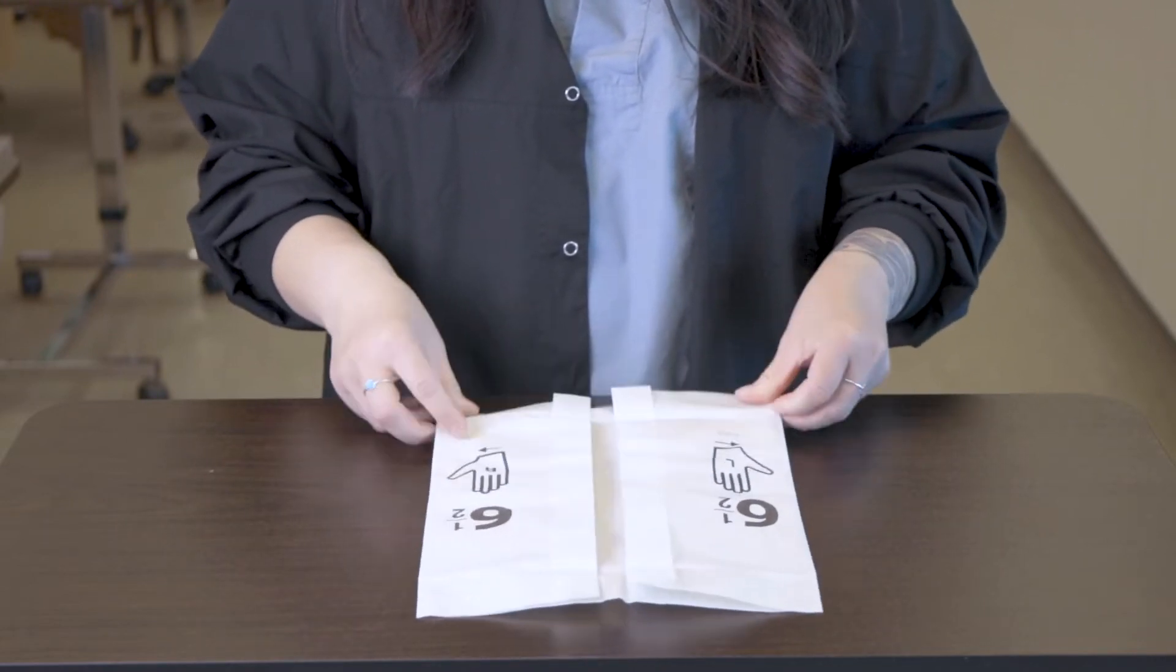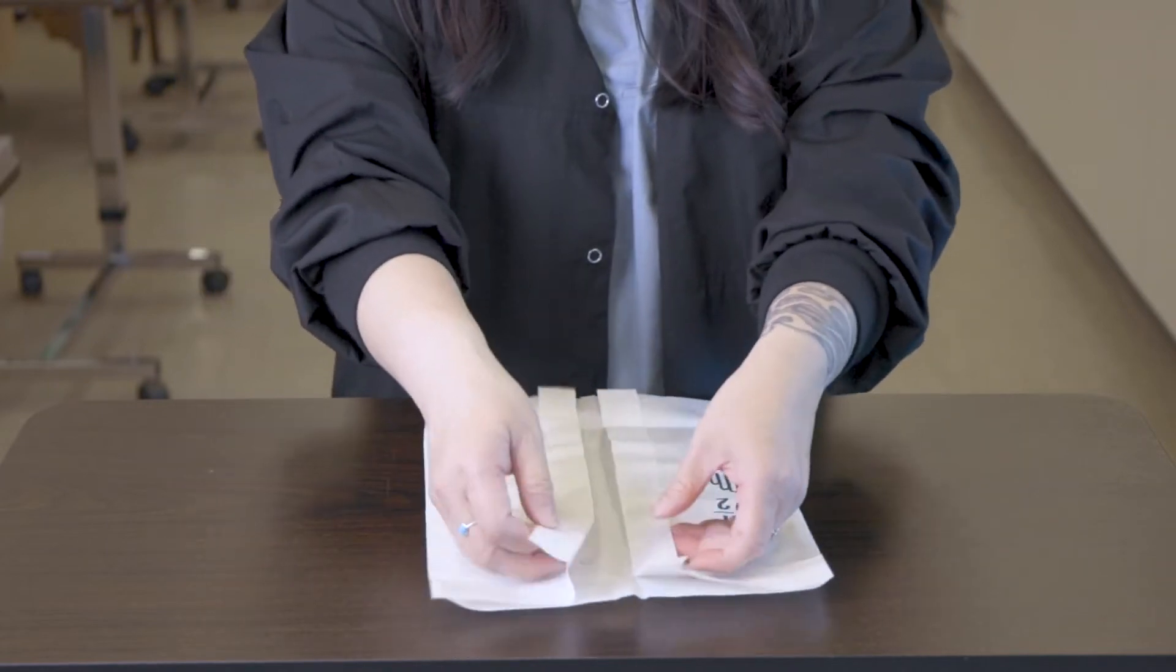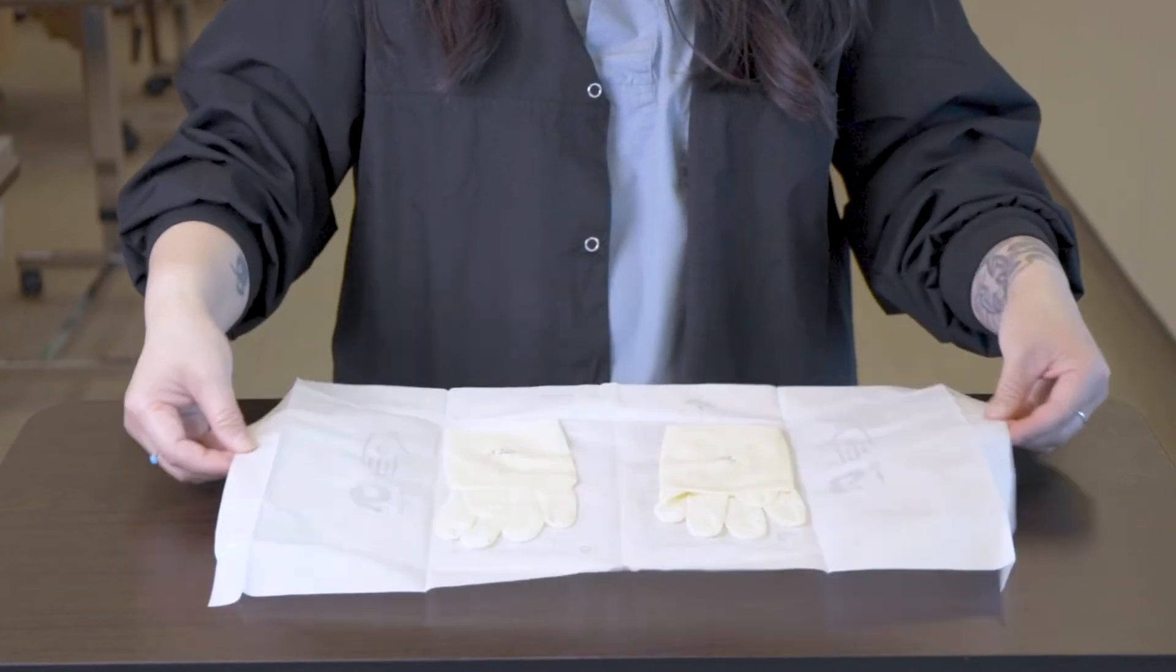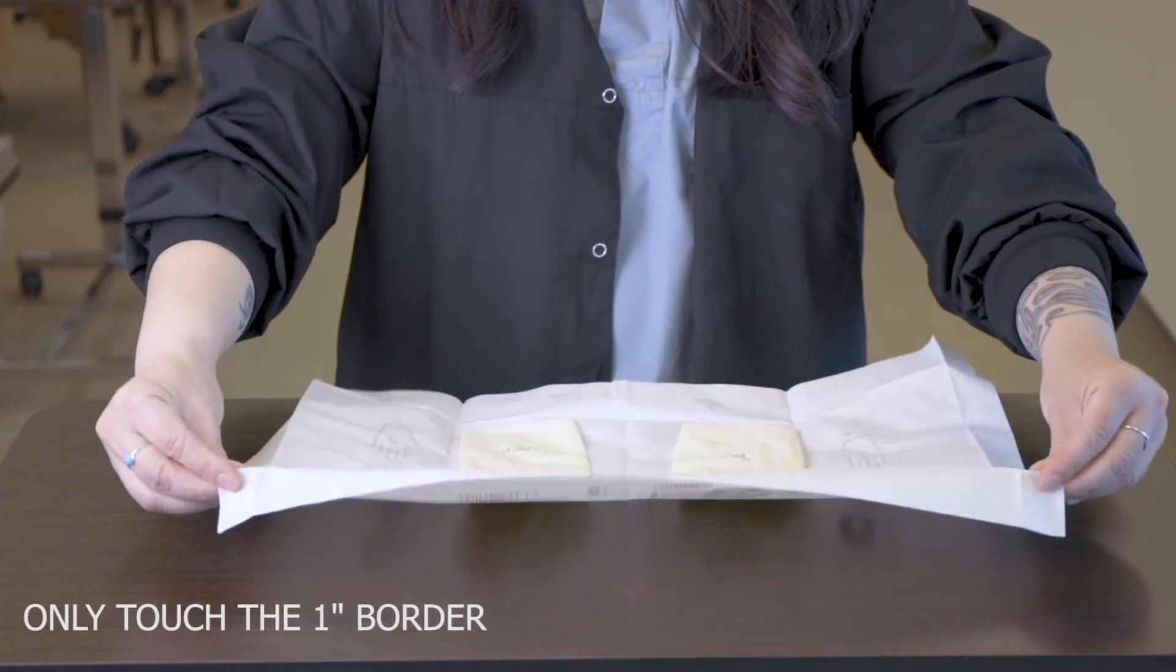Remember that the one inch border of the field is considered non-sterile, so I'm making sure to only touch the one inch border with my clean hands.